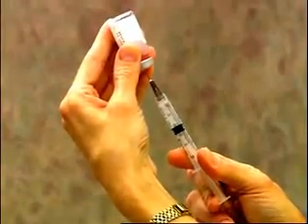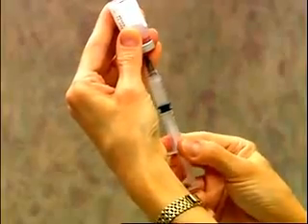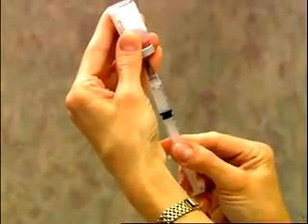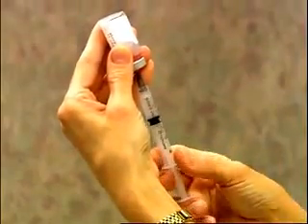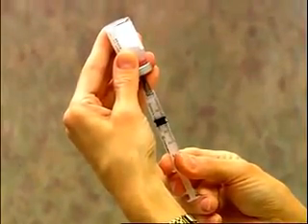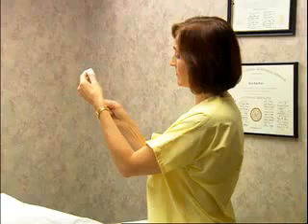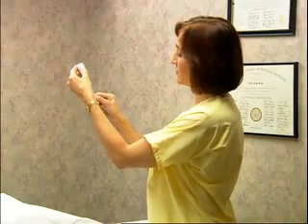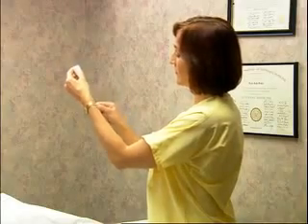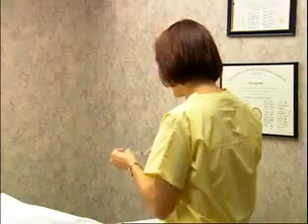To remove any air bubbles that may have formed in the syringe, gently tap or flick the barrel of the syringe with a finger of your free hand while continuing to hold the vial in the inverted position. Bubbles will rise to the top of the syringe and can be expelled back into the vial by slightly depressing the plunger. Recheck the amount of medication in the syringe and draw more solution into it if necessary. Remove the needle from the vial and very carefully replace the needle cap.